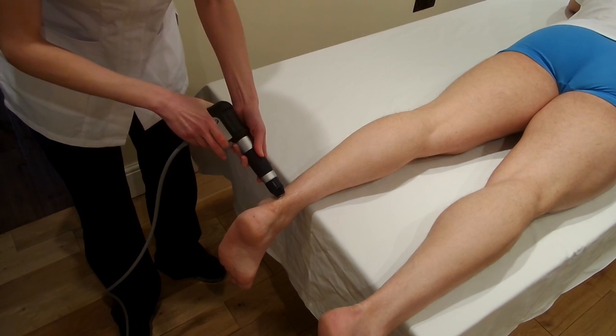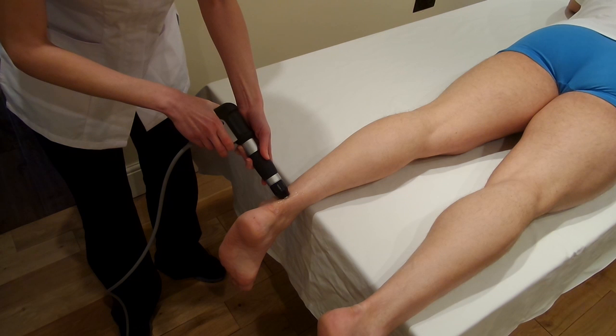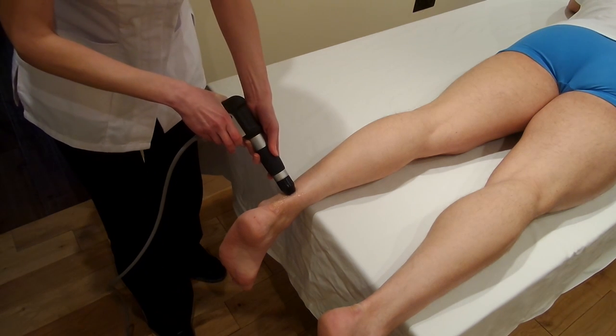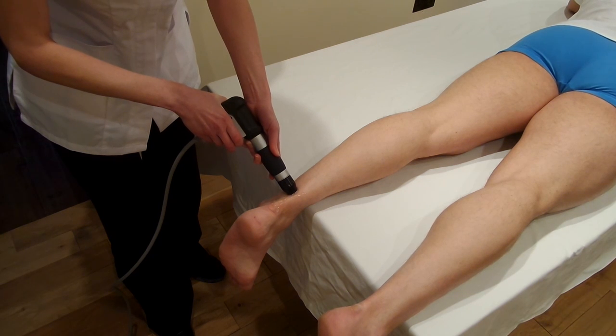It's commonplace to come onto the Achilles tendon from each side. This treatment is in 200-shock intervals: from the outside of the Achilles tendon shooting through towards the medial aspect — 3 spots in this area — then 3 spots coming down through the Achilles tendon from above, then 3 spots from the inside, and probably just one spot right at the very bottom where the Achilles tendon meets the calcaneus.